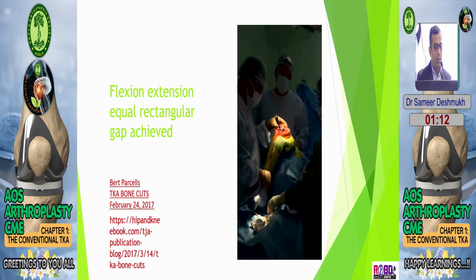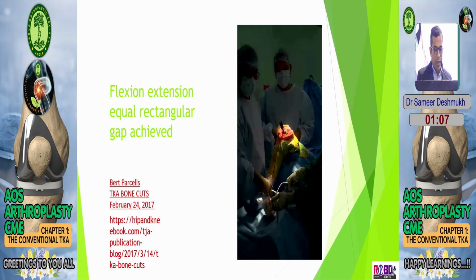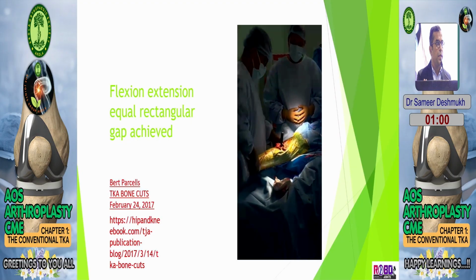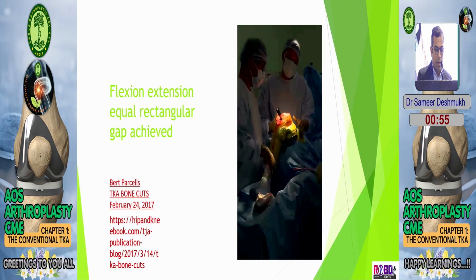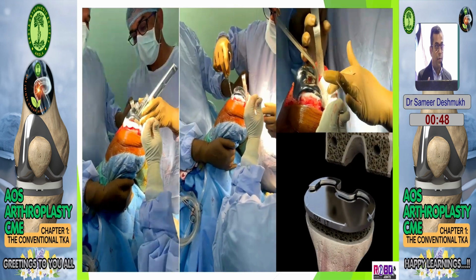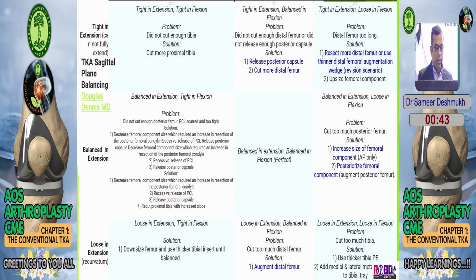So this is how we check in flexion, at 90 degrees of flexion, and then at 0 degrees of extension. That is 180 degrees, you can also check, and just see whether all the gaps are equal, and both the MCL and LCL are balanced. Then put the components, lateralize the femur and tibia components, and if you are changing the patella, medialize it, and cement. And this is the flow chart, which I think you should take a photo of because of the constraint of time.